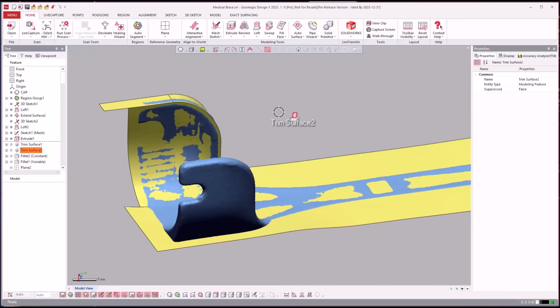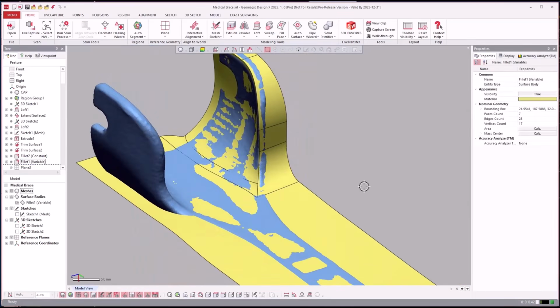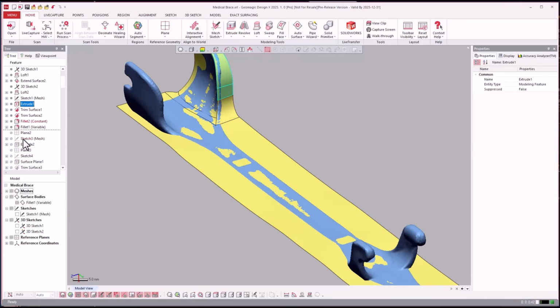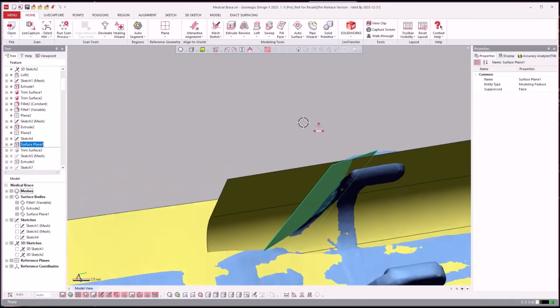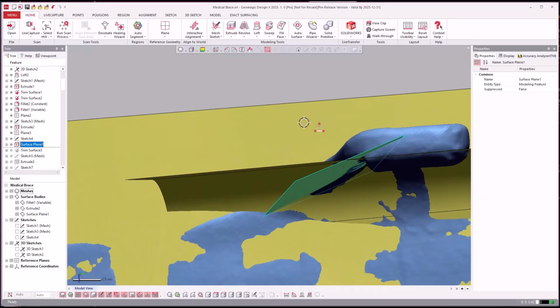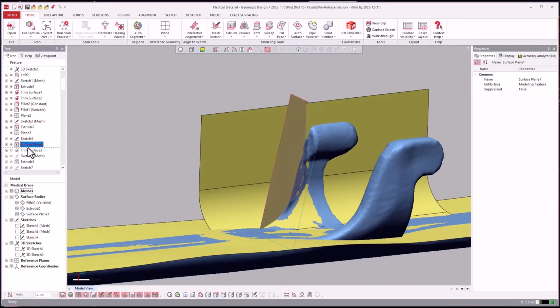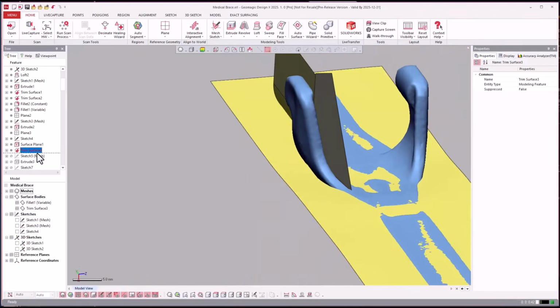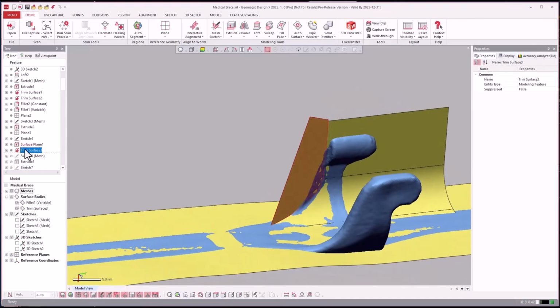And then we're going to trim all that together. Very little fillet cleanup there. Looks good so far. And then the other thing is modeling half of it and mirroring it across is obviously what's going to happen too. Now we went ahead and did an extrude surface there. And then there's another, because it has a little, if I just hide the surfaces there and then turn them back on, you'll see where we go with this here. Because it has a slight angle to it. You can see it on this side here. So we trim those two together.